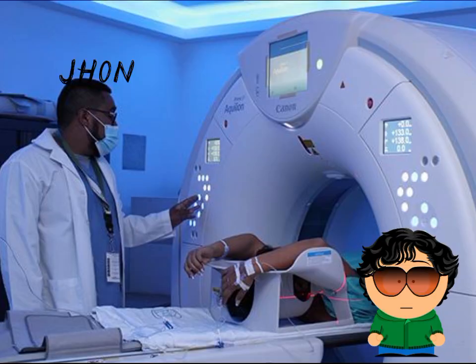Generalities of tomography. Tomography is a medical imaging technique that allows visualization of sections of the human body in different planes. Here is a general medical overview. The word tomography comes from the Greek tomos, cut, and graphos, representation. It refers to obtaining images of body sections, allowing internal structures to be seen without surgery.